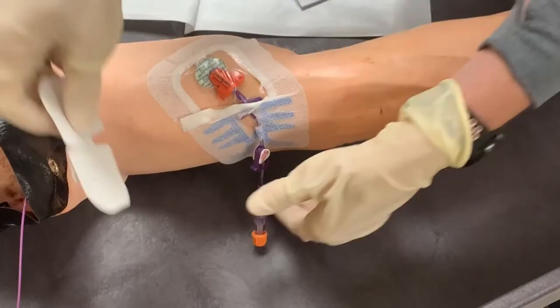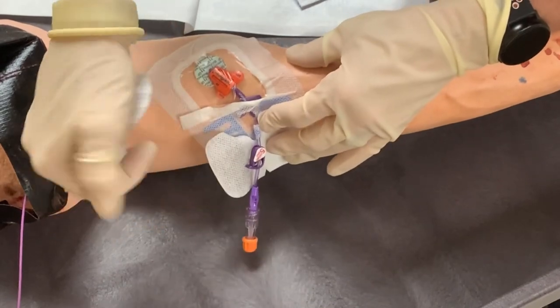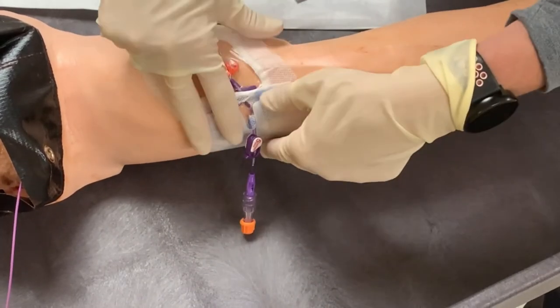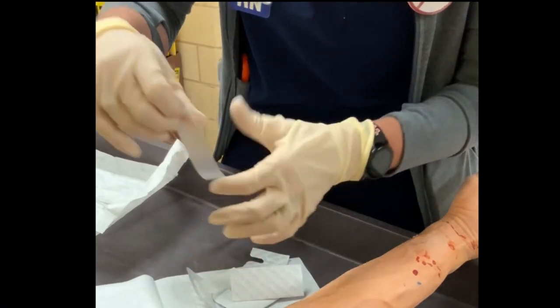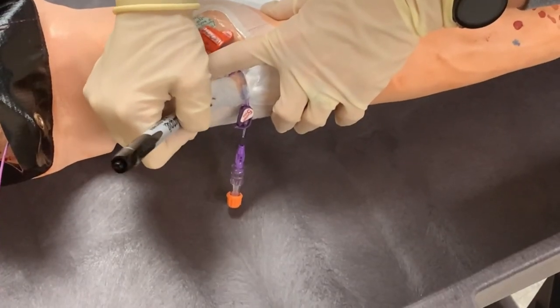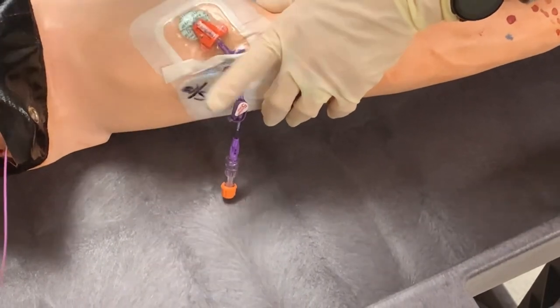The pants should be placed under the catheter. Lift it up and slide the pants up over the end of the shirt. This should cause the dressing to fully surround the exposed catheter. Finally, the belt is a strip of dressing or tape that should be placed over the seam where the pants meet the shirt. You will also need to date and initial the belt. It is very important that the dressing be dated. If your patient has a dressing with no date written on it, assume that this dressing has been on too long and replace it with a new one.